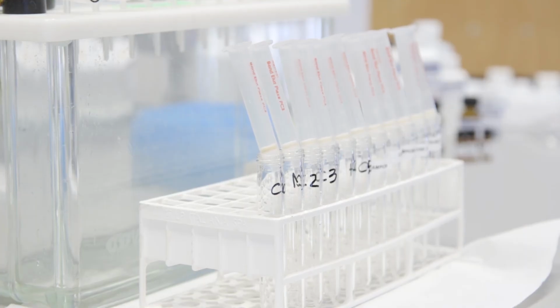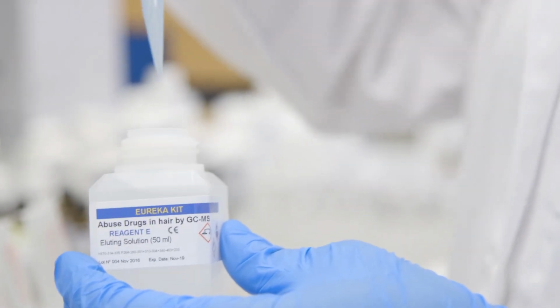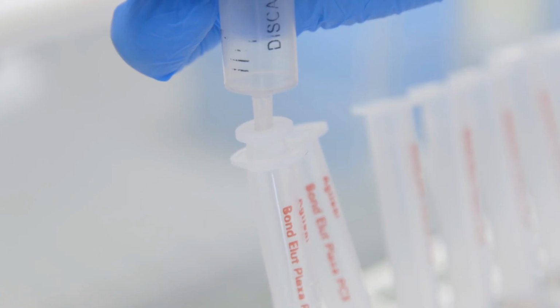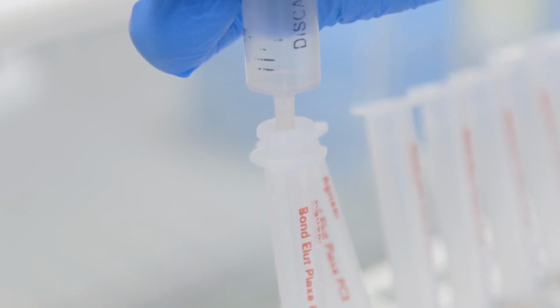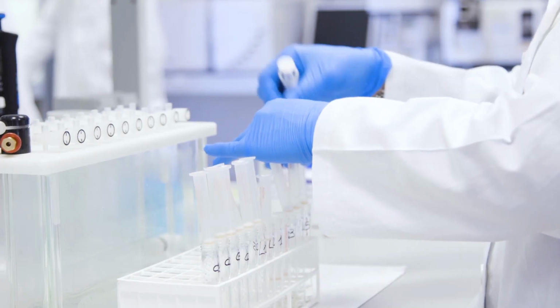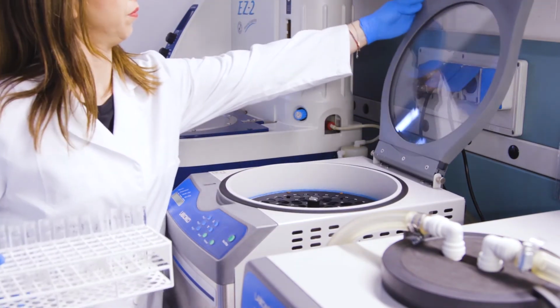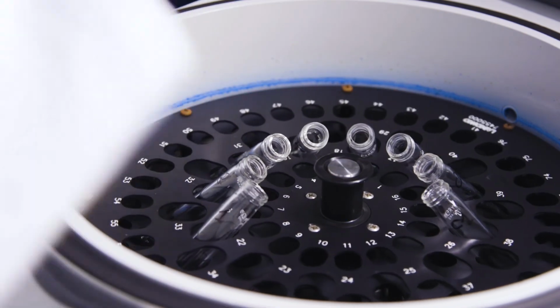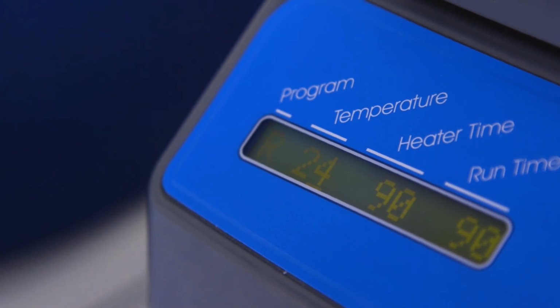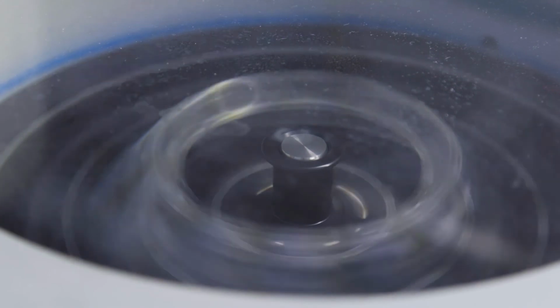If we're looking for amphetamines, proceed to elute, adding 1 ml of reagent E, eluting solution. Even in this step, we dry the column with a gentle airflow. Collect the eluate in Pyrex glass tubes and vortex. The eluate should be dried with the help of a stream of helium or nitrogen, making sure that the temperature remains below 40 degrees Celsius, or even better, through the evaporator or concentrator.